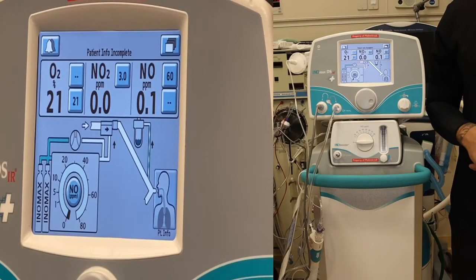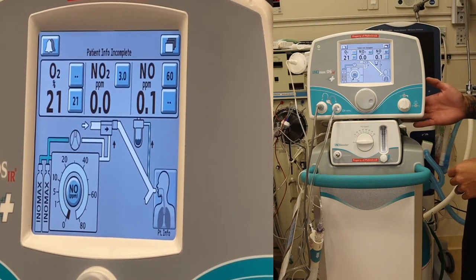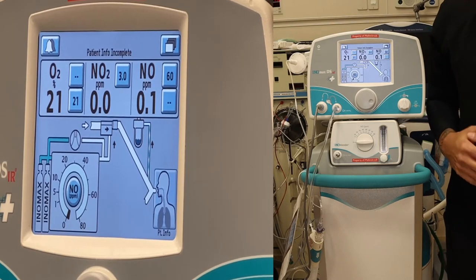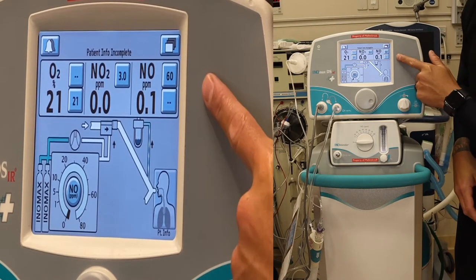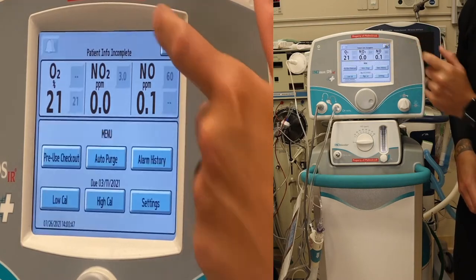First, turn on your machine by flipping the power switch found on the back side of your monitor. With the DSIR Plus, the machine will automatically go into a low calibration. From your home screen you'll see the pages button on the top right hand corner — go ahead and press that.